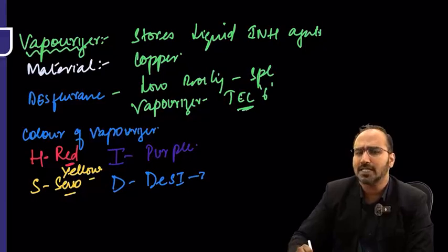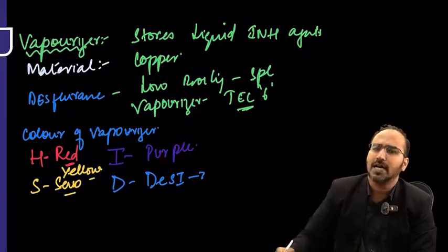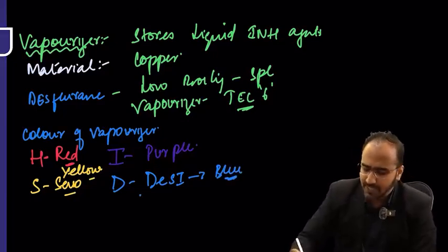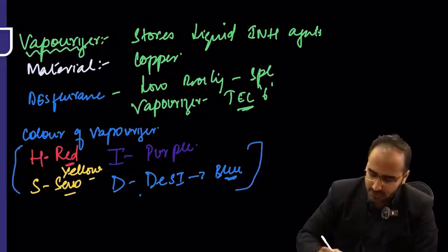Why do we need to remember Desi? Desi means India. The cricket players of India, what color jersey do they wear? Blue color. So remember, desflurane is Desi, hence it is blue color, right? So this is regarding the colors of vaporizers to remember.